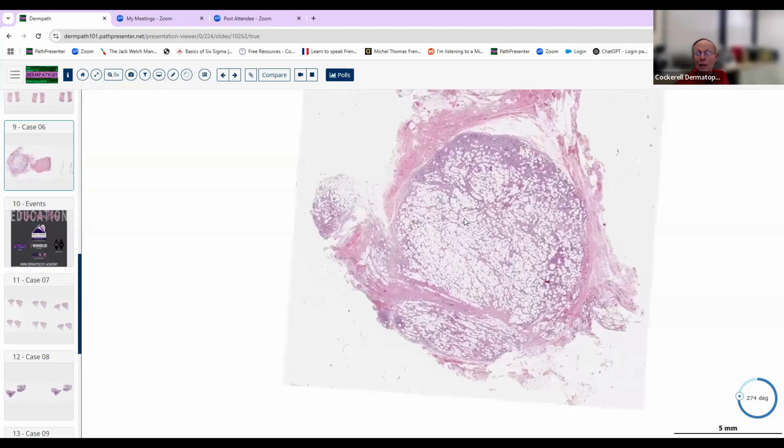Well, it's certainly got a lot of clear white areas. And we know what lives down here is the fat. And so we think right off the bat, it may be an unusual lesion of fatty differentiation. And there are probably about 8 to 10 different fatty neoplasms.